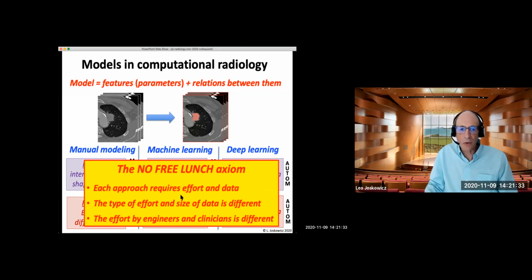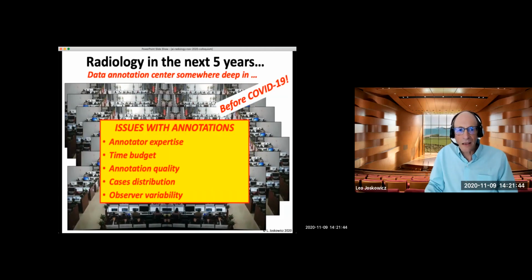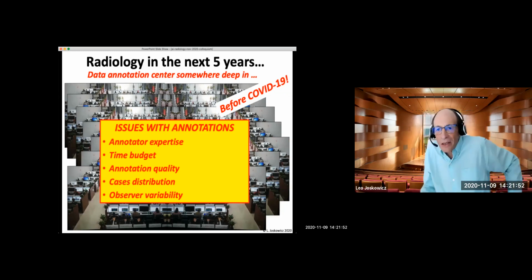So you can see that the nature and the type of effort is very different in each one of the cases. And what I want to focus on is how this differs in the case of radiology, okay? Some radiologists fear that this is going to be the future for them. Basically, they're going to become annotators. You and I cannot do the annotation because it requires quite a number of years of study to understand how to annotate and how to classify these things.